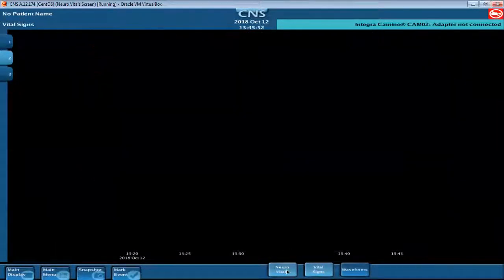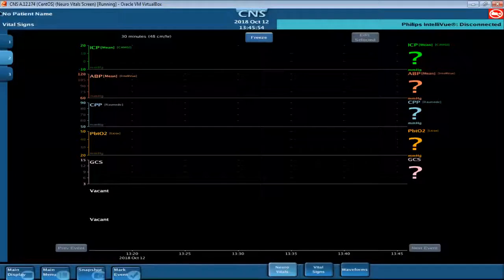And then there's a discharge step. That's also a very basic place that you can begin building, but it doesn't contain any EEG. So if your hospital needs EEG, we would want to make sure that we build from that longitudinal bipolar protocol.